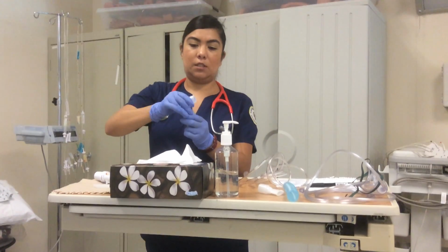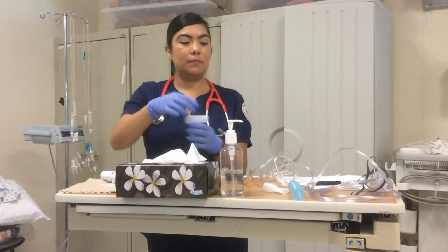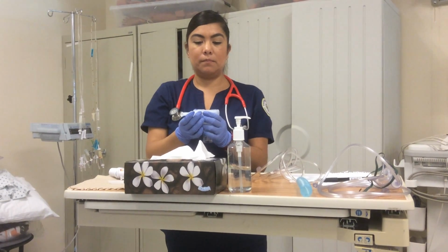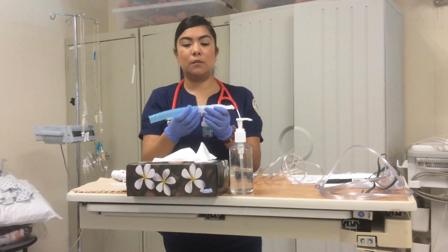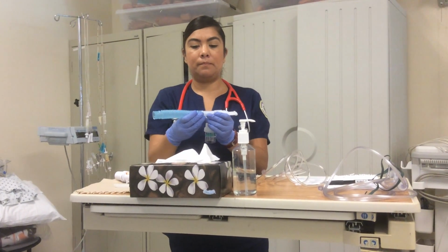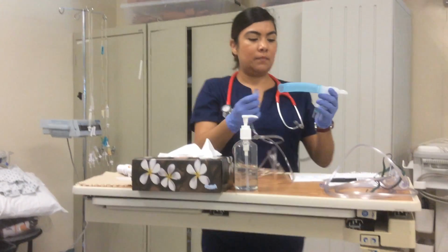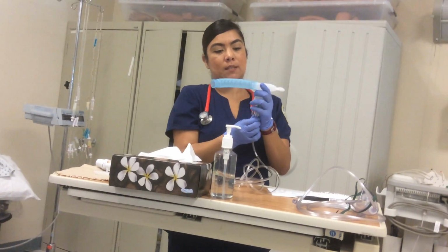And so this is usually detached. Now we'll just attach it. Okay. Here is basically the mouthpiece with corrugated tubing. This is a small nebulizer treatment for patients. And the medications we are using are albuterol and ipratropium. Albuterol is 2.5 milligrams, and ipratropium bromide is 0.5 milligrams. You just put this here because we need a gas source for the devices that we're going to be using.